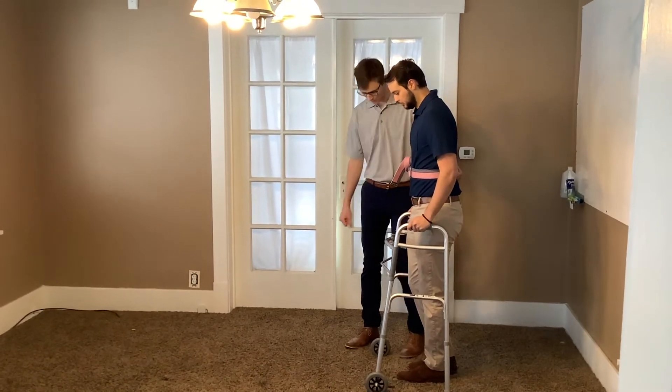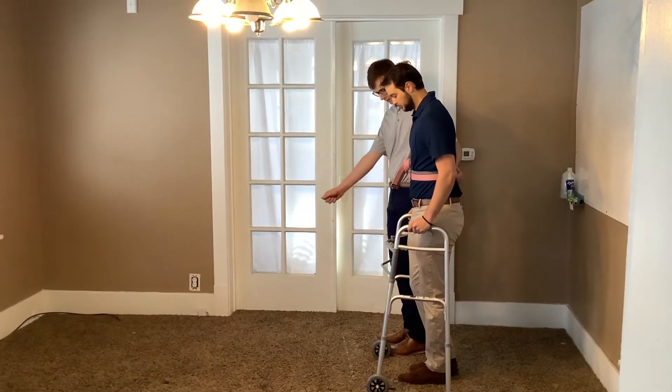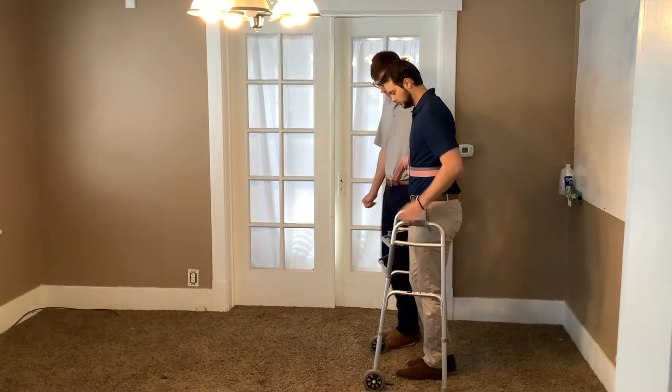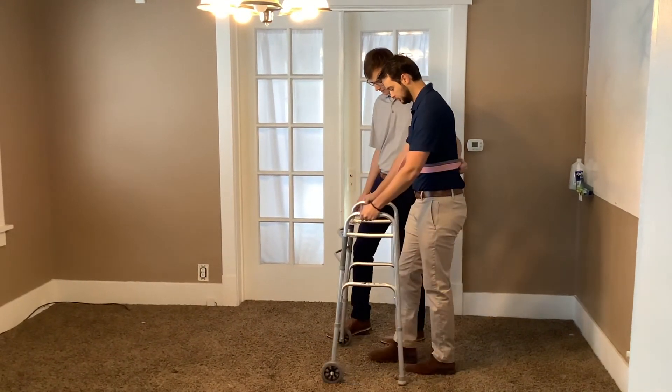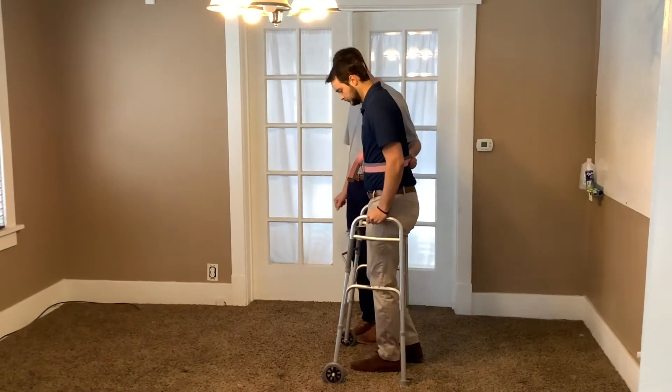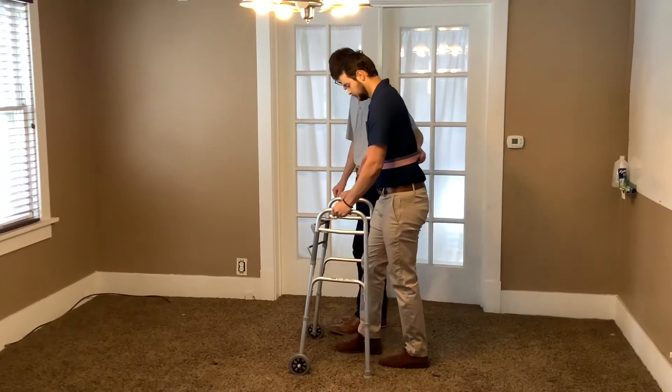So what we're going to do, Trevor, is put that walker forward, push with our hands, and then take that right leg and just toe touch — so we're just going to have the foot touch the ground. Follow through: walker push, toe touch.